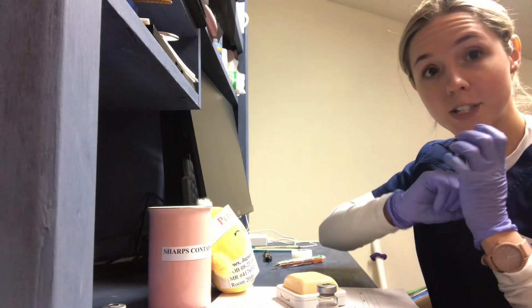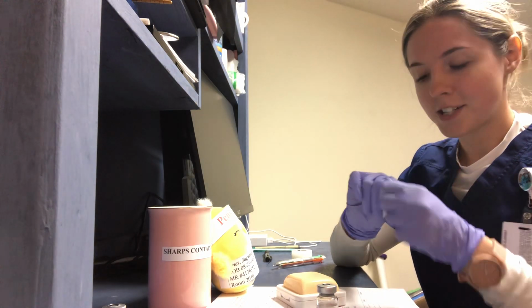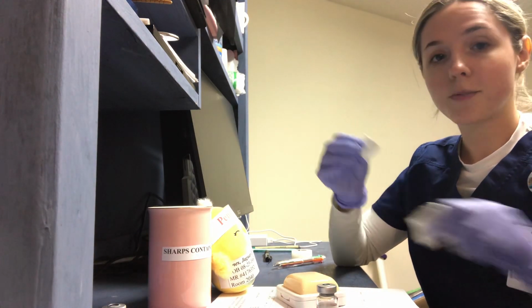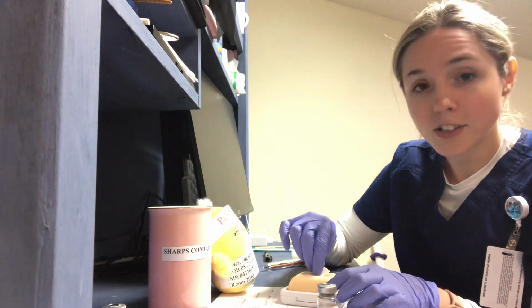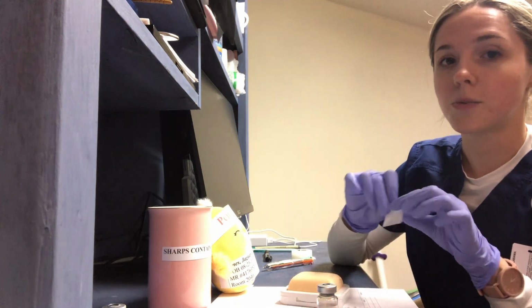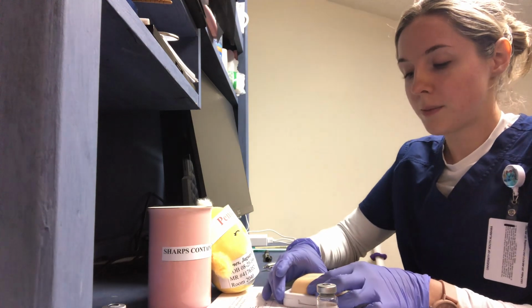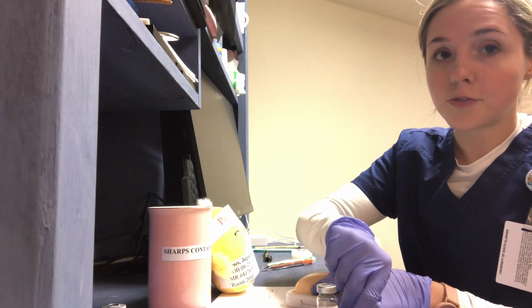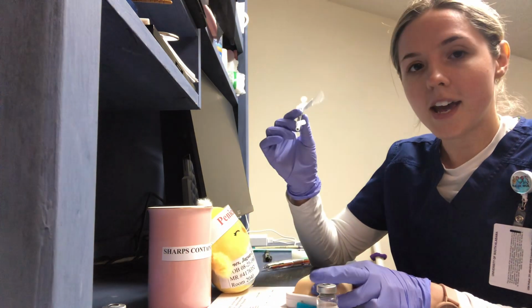So for this, we are going to want to clean our patient. And to properly clean, we want to start in the center, move in a circular motion outwards, not going over the same spot twice, don't want to contaminate. And then we are going to pinch.